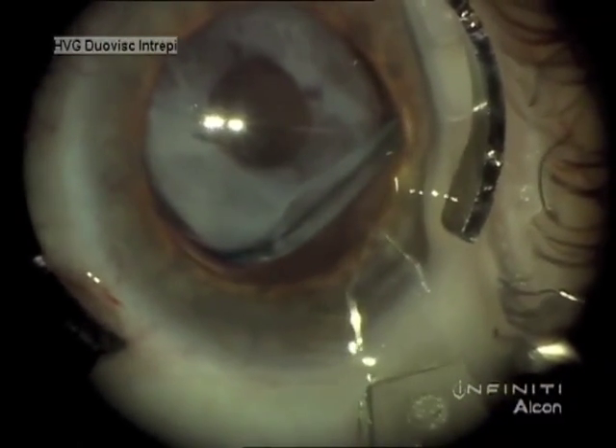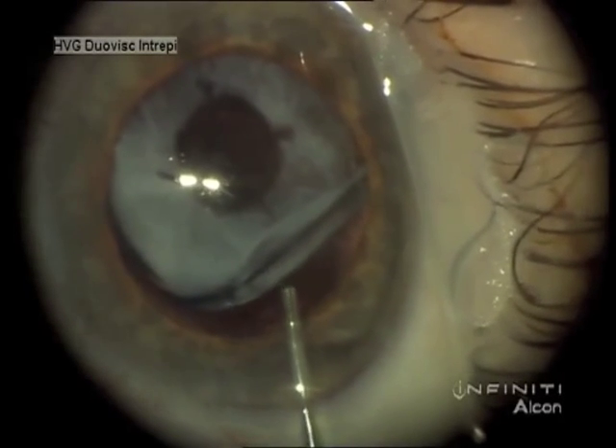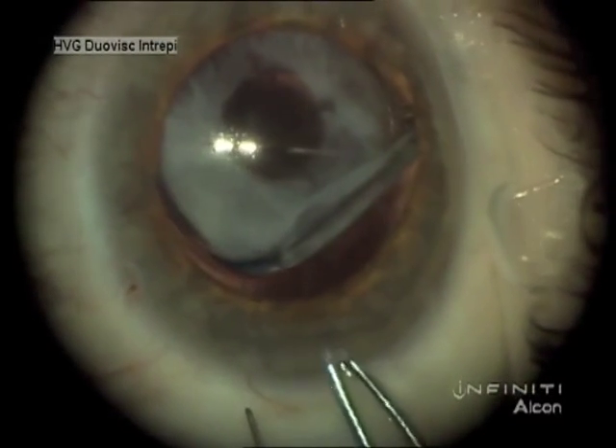One could also consider sulcus fixation, scleral suture fixation, or iris fixation. In the older age group with good endothelial cell count, I use the anterior chamber lens.